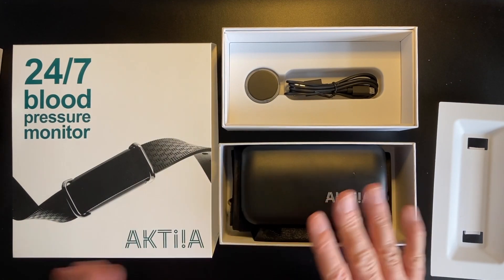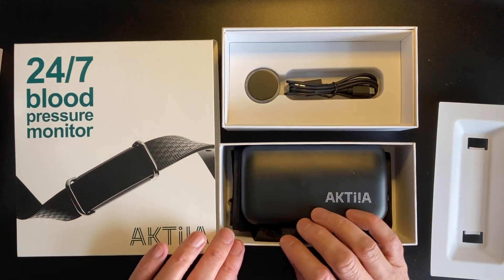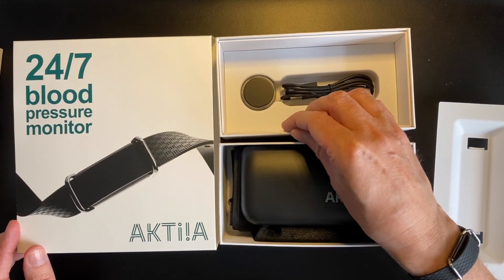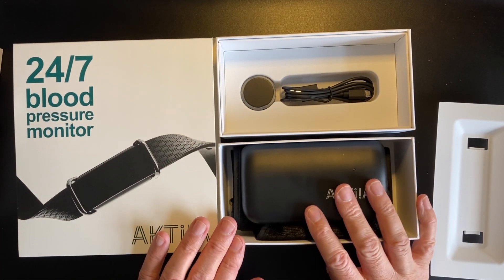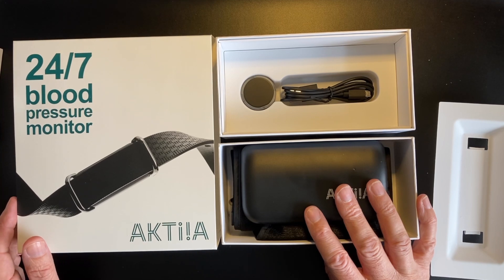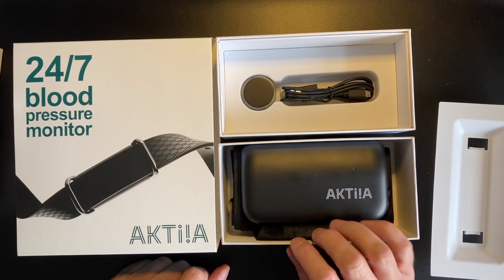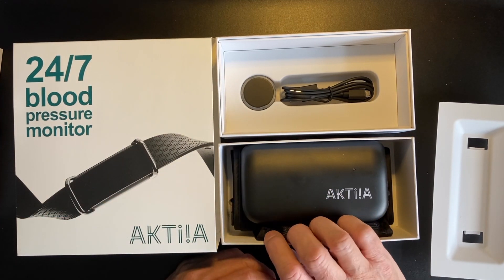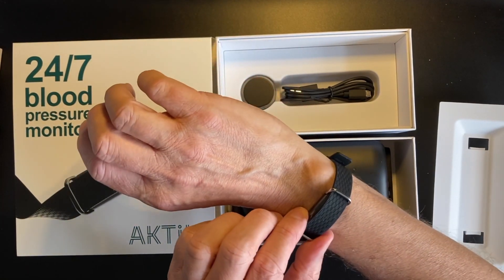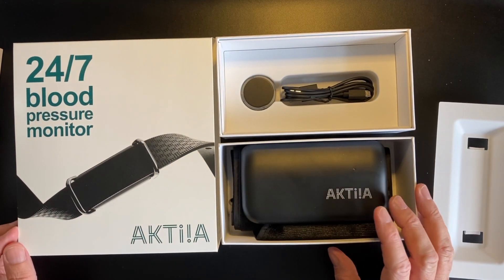So why would you need a blood pressure device? You may, like me, have hypertension — or you may not. But according to a regular blood pressure cuff, you may often find that when you visit your doctor you get a very raised blood pressure reading, yet at home you have normal blood pressure. A raised blood pressure at the doctor is called white coat syndrome — you're stressed when you visit. This device could be a real game changer to help people understand what is really happening: do you really have high blood pressure, is it elevated, is it low, or is it just about right?